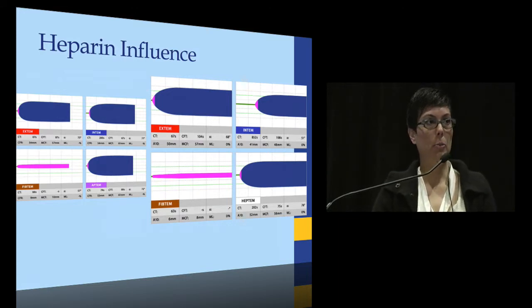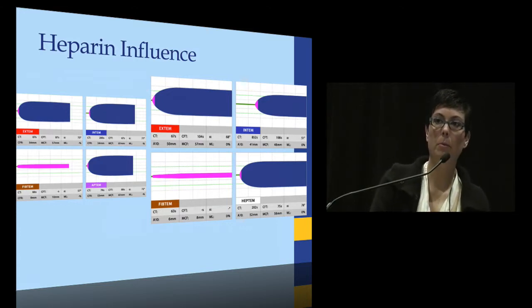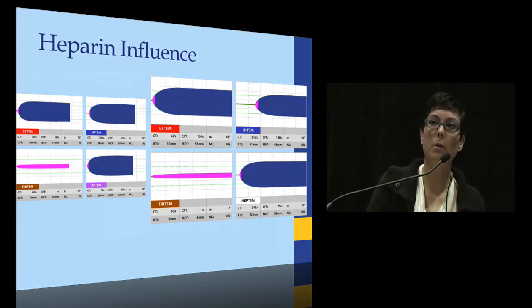So again, this is by no means a complete evaluation of the ROTEM, but you can now start to see how you can get much more elaborate information from the ROTEM as compared to the TEG, although it does make it much more complicated.